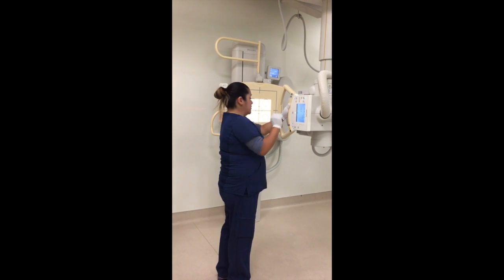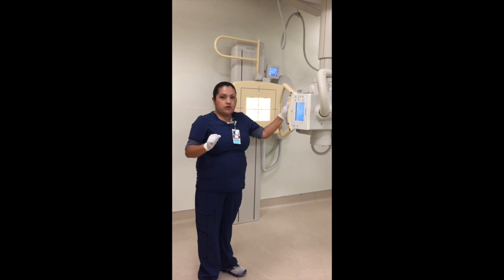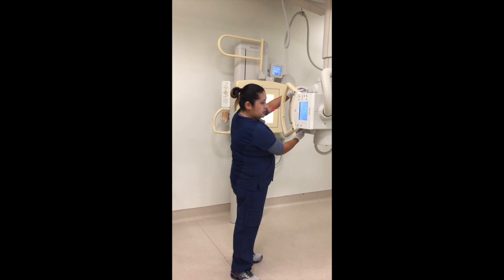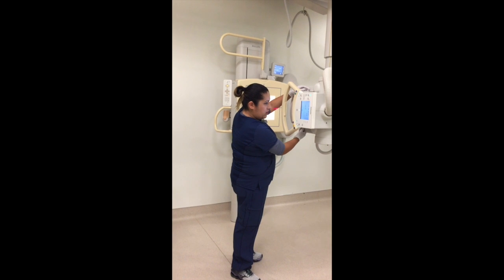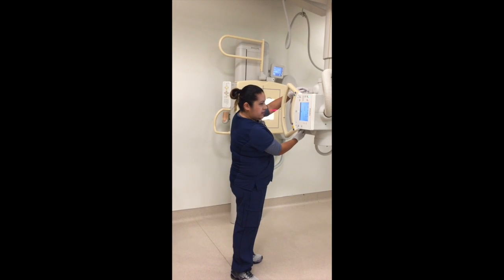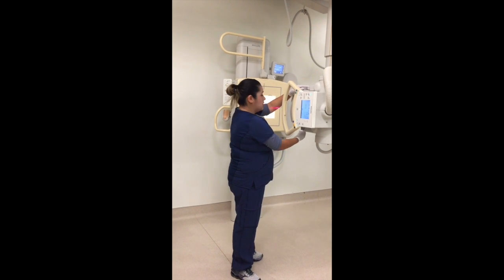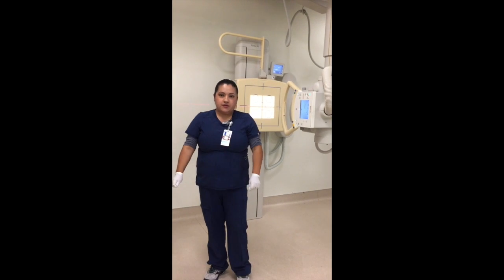And then the first image I'm going to start with is my lateral. So I'm going to go ahead and collimate to 10 by 12 crosswise. And now I'm going to go get my patient.